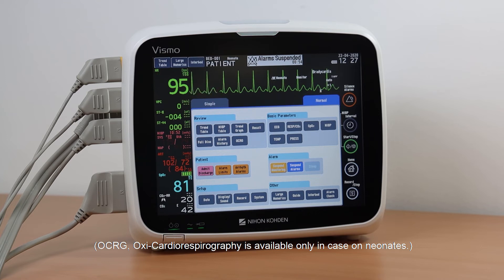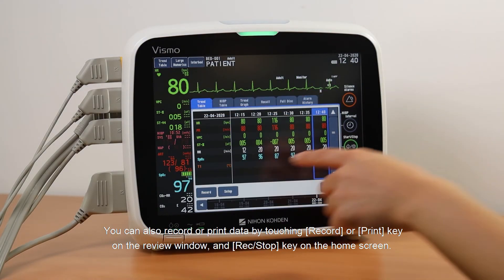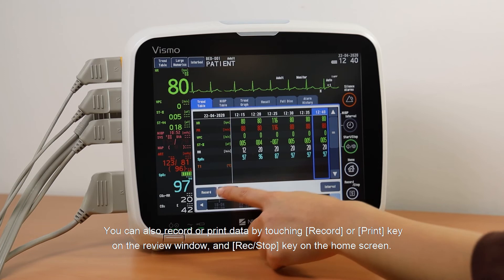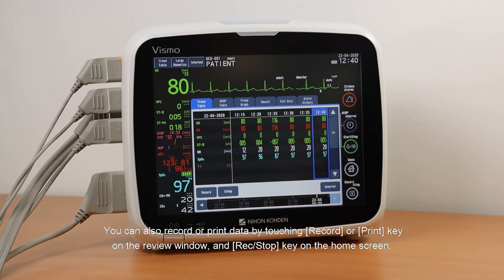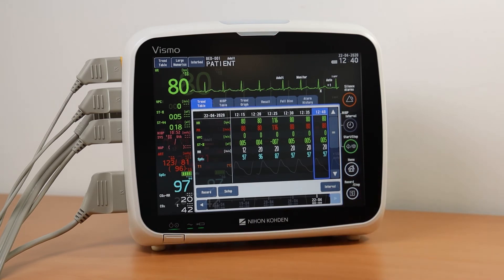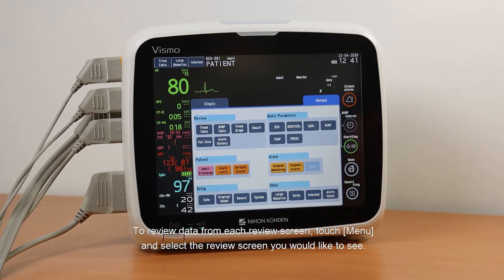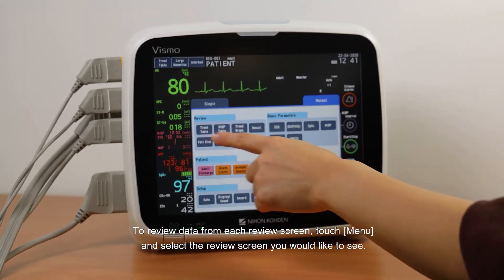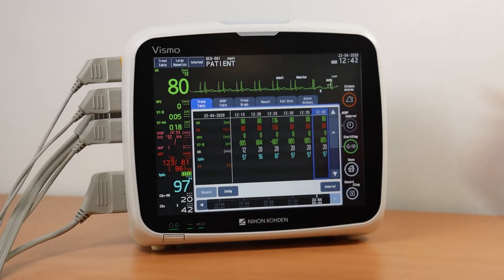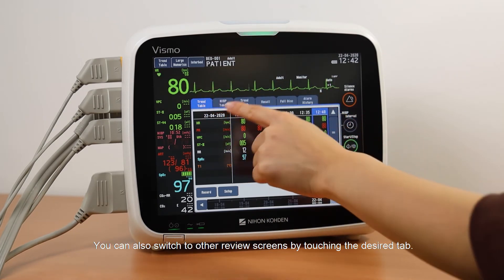OCRG (Oxycardiorespirography) is available only in the case of neonates. You can also record or print data by touching the Record or Print keys on the review window, and the Rec/Stop key on the home screen. To review data from each review screen, touch Menu and select the review screen you would like to see. You can also switch to other review screens by touching the desired tab.